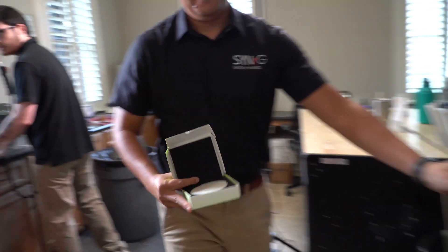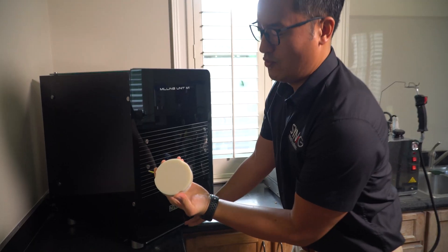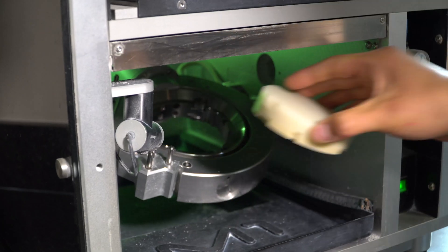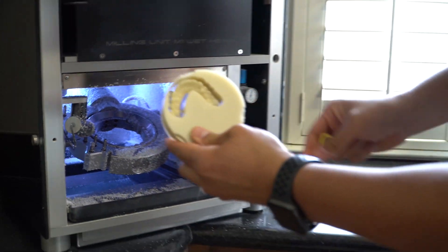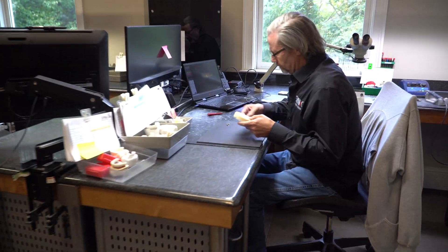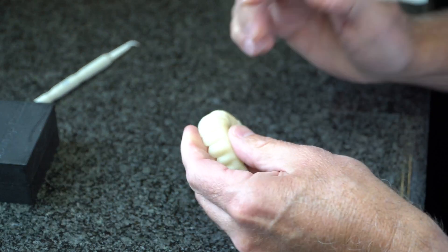We go to ExoCAD design, which goes to the Zerkonzahn M1 mill that we utilize for very accurate milling of the Tempesthetic from Harvest, which is our PMMA puck — multi-gradient, very lifelike, translucent material, and it also has great strength. We make sure that everything not only is aesthetically pleasing, but it's 100% accurate.